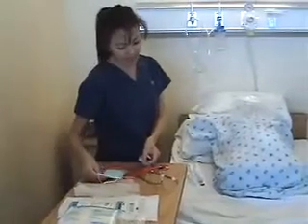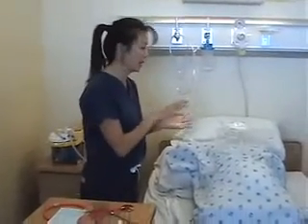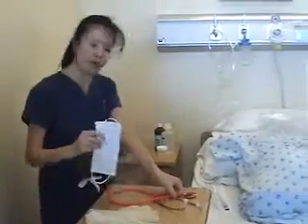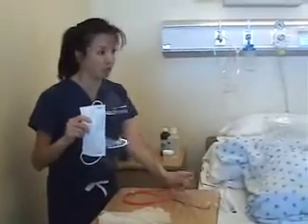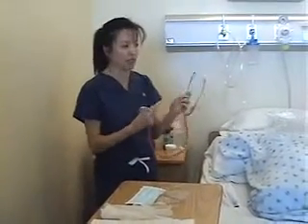Basically this is an uncomplicated tracheotomy care. You want to do the suctioning, and then you want to take care of the site. Then you want to do a dressing change of that. Because of the tracheotomy, most of the people do have respiratory problems. So the number one thing you want to do is assess the patient.